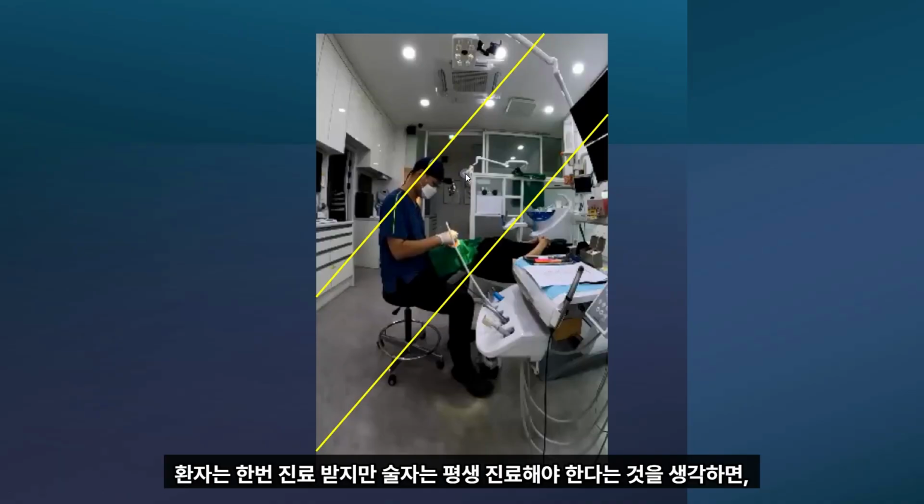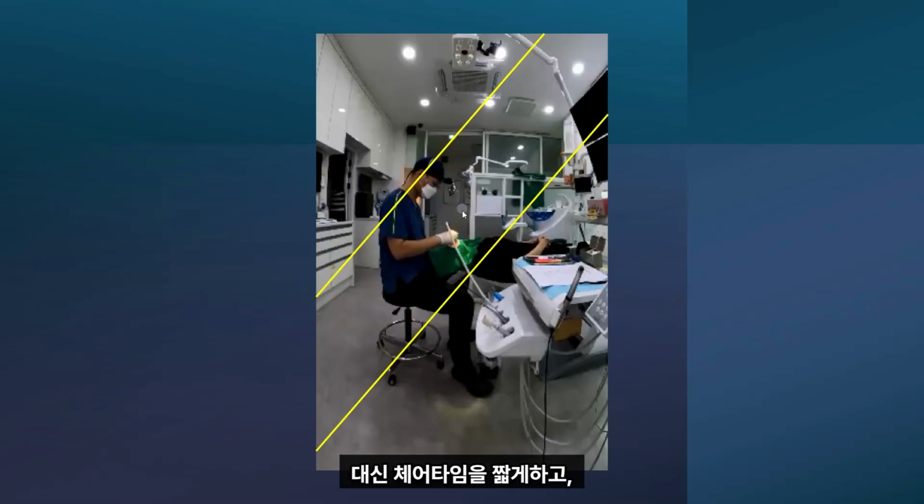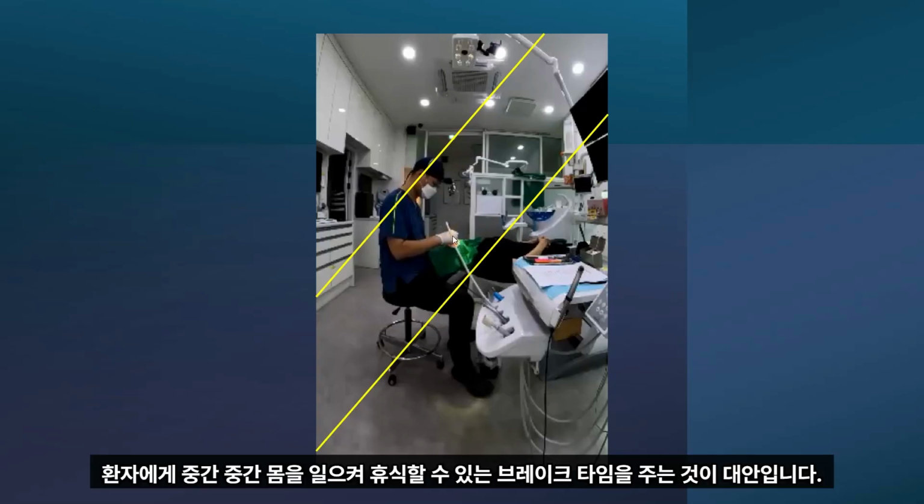Considering that a patient is treated once, but the operator treats for a lifetime, I believe it's better to set the patient's neck as shown in the picture, even if it means prioritizing their comfort less. Instead, an alternative is to shorten the chair time and give the patient break times to sit up intermittently.